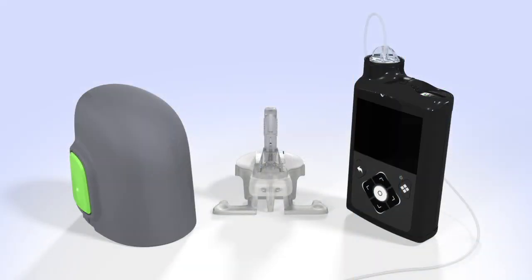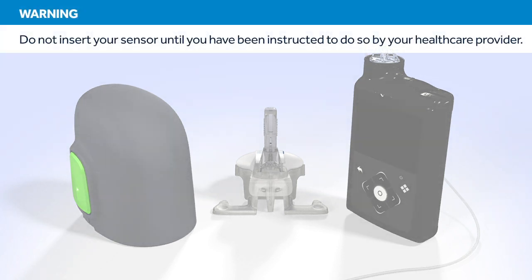In this video, we will show you how to insert a Guardian Sensor 3. Do not insert your sensor until you have been instructed to do so by your health care provider.